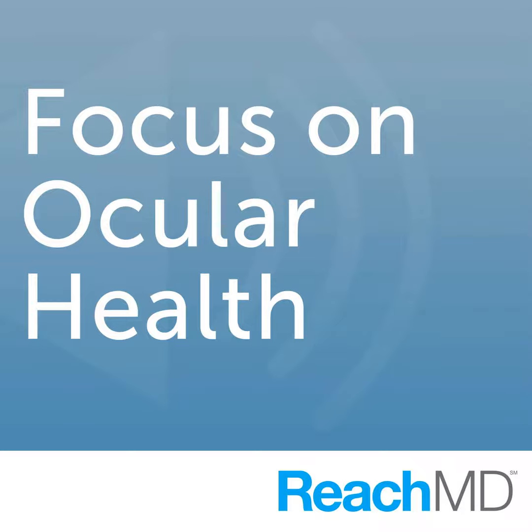Now, I guess there's no color perception, it's only black and white. Well, it's interesting you ask about color. Our patients, our subjects do report color, and they see deep oranges, blues, and sorts of yellows, and it's very exciting. But we don't know what in the software or the device is eliciting that color. So one day, using the same parameters, we get blue, and other days we get orange. So we do need to develop a further understanding about how to do that. Clearly, it's a big aspect of our vision, something we all enjoy. But on the other hand, black and white is very good and allows you to do most everything we need to. What is the next step?